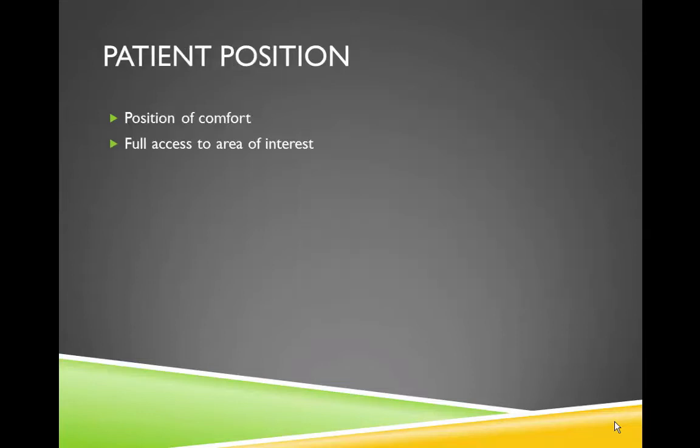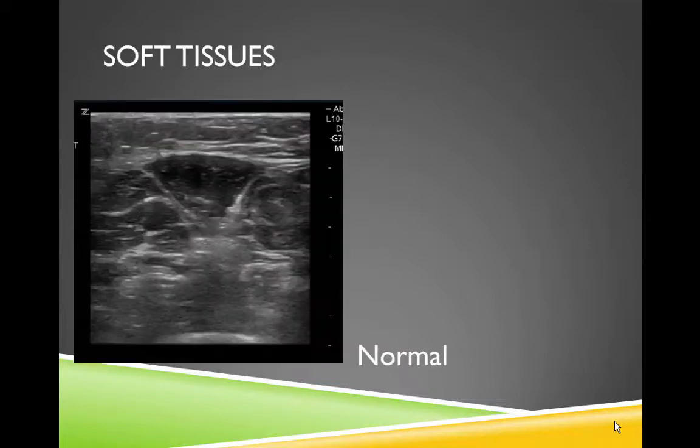And patient position is pretty easy, just wherever they're comfortable and wherever you can get the probe to the area that's infected, and that's going to be different depending on the location.